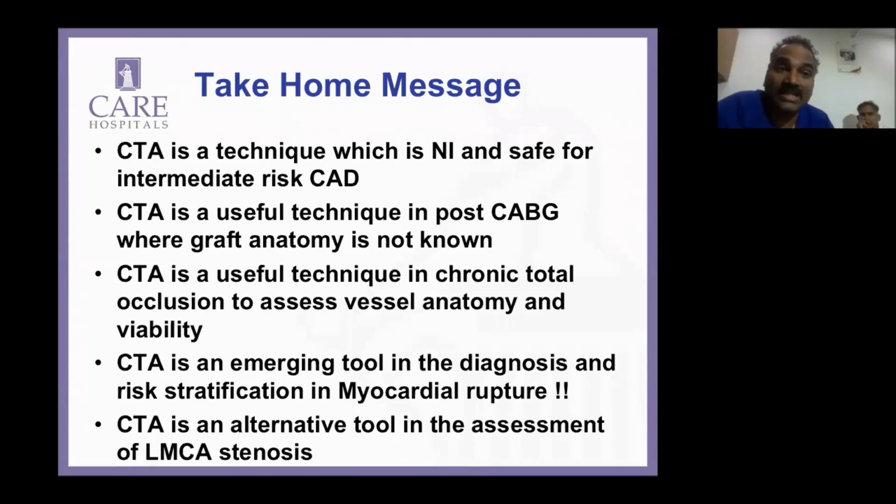So if you start seeing CT more and more, and analyze your interventions retrospectively, it gives a lot of insight into your interventional planning. It's very difficult for all of us to understand somebody's experience unless you go through it and retrospectively analyze your intervention. You don't understand the insight which CT gives, especially in a complex intervention.